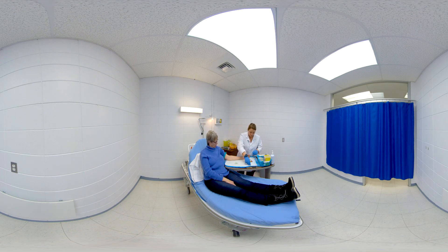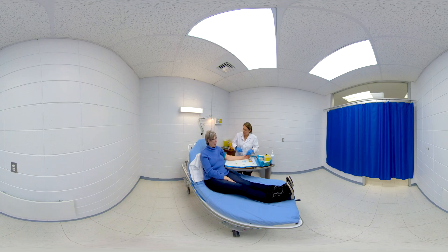The laboratory technician must be careful not to leave the tourniquet on the arm for more than 60 seconds, as this will cause hemolysis of the red blood cells, which will distort the results of the sample.